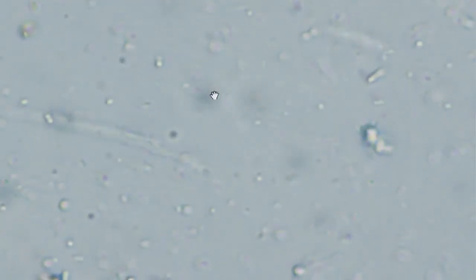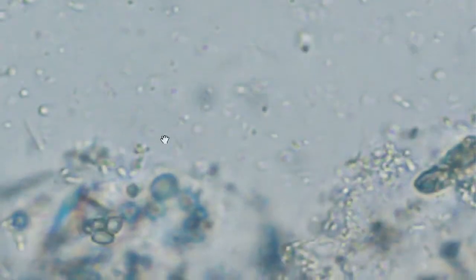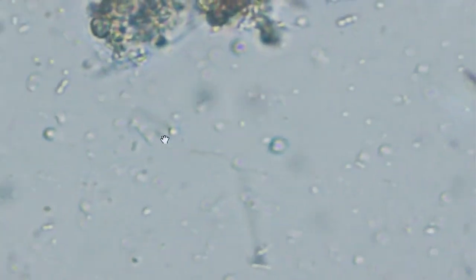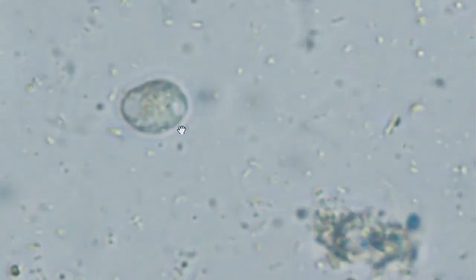But as you can see, it's not easy. It's really not easy to make the differentiation of the Entamoebas in wet prep, and I highly recommend that you do not do that unless you have no other choice. What we really need to be doing is permanent stained preparations.